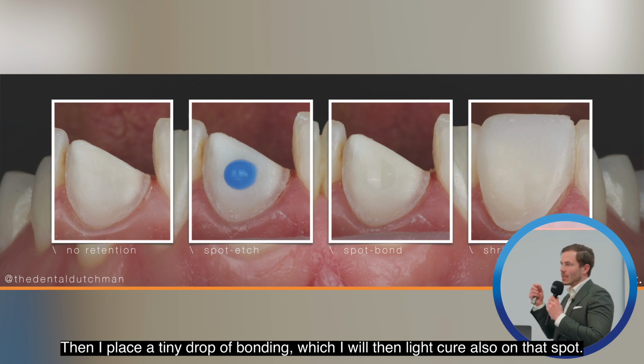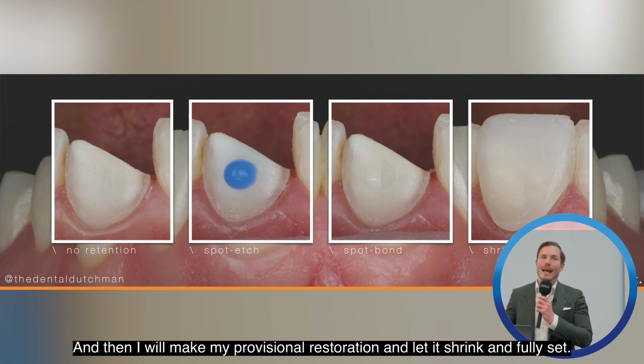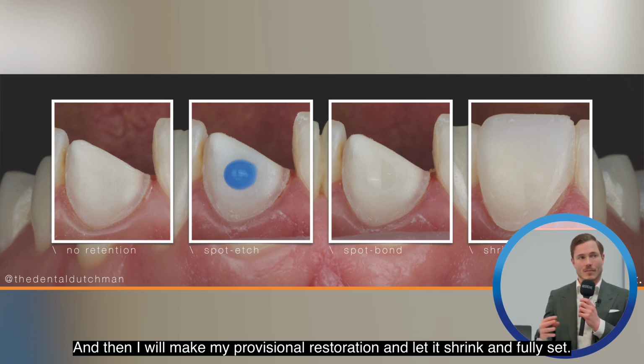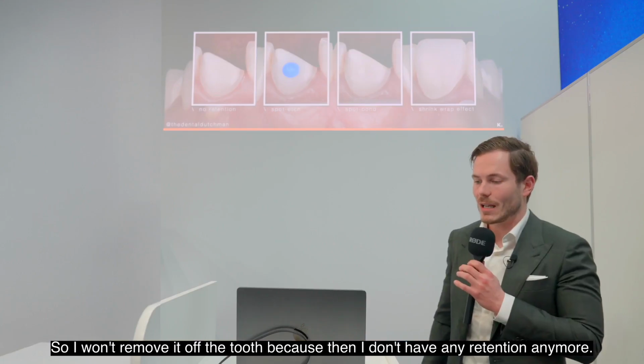Then I place a tiny drop of bonding, which I will then light cure, also on that spot. And then I will make my provisional restoration and let it shrink and fully set. So I won't remove it off the tooth because then I don't have any retention anymore.